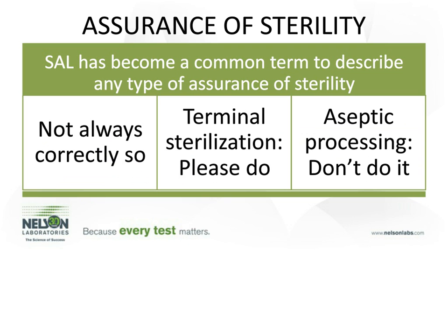Now, sterility assurance level has been used in a variety of ways, and not always correctly. And so we are going to try to provide some guidance on when it should be used, and it will point towards when you are using a terminal sterilization process, that would be expected. When we're talking about aseptic processing, sterility assurance level should not be applied. That's what this reinforces right here. Don't do it.